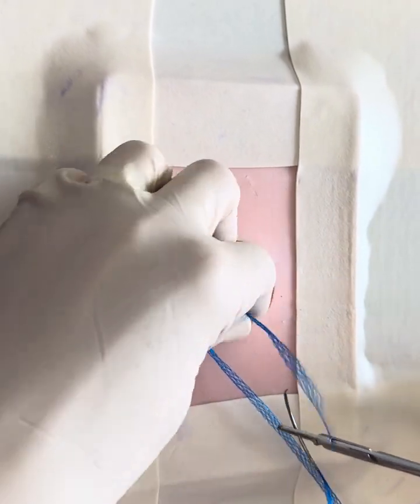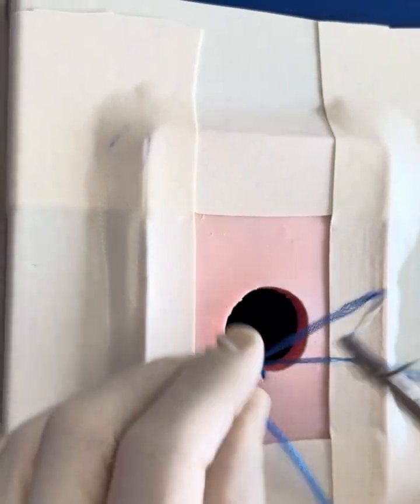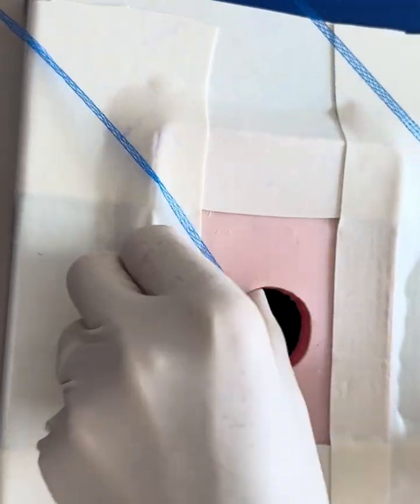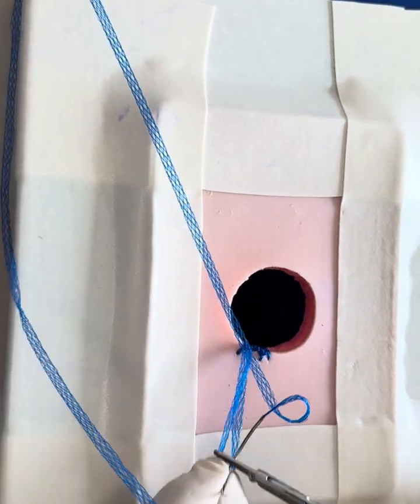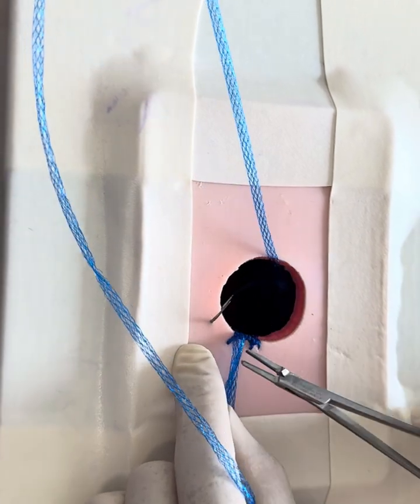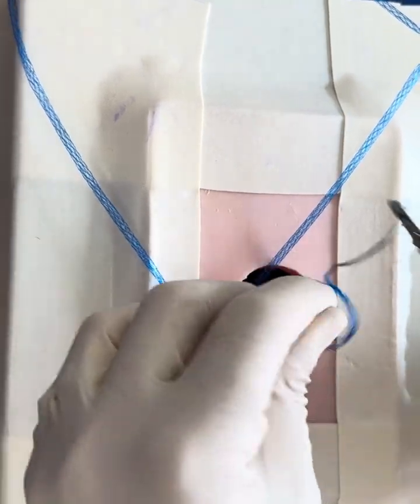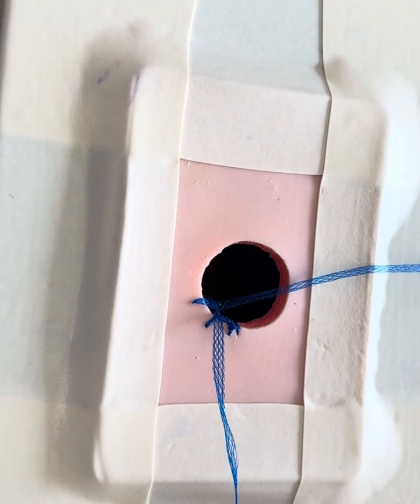And then we are going to do a mattress repair. So we come back through our loop, and what that does is encourages the Duramesh to lie along the edge of the hernia or stomal defect. So, and then we continue our progression. I don't want our bites to be too big. And then once we get going, it naturally sits in a position to perform an ongoing mattress repair.